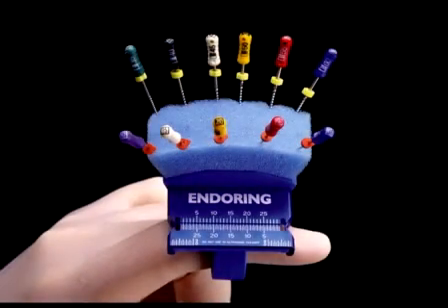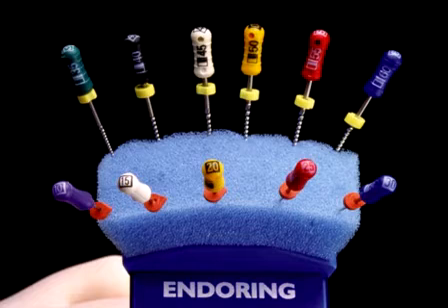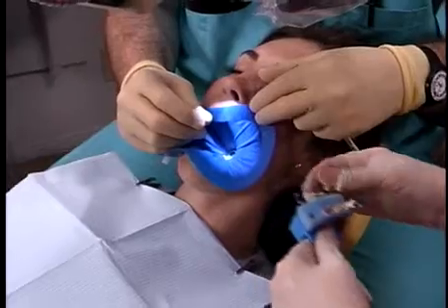The endo ring is an excellent device for the dental assistant. Not only can it hold the instruments, but it has a measuring ruler and a small well to place a rubber stop so that they can be very accurately placed on the shaft of the file. In the front row, we have a stainless steel 10 and 15 with unidirectional stops. The 20, 25, and 30 are still stainless steel, but they're flexo files which give us added flexibility. In the back row, we have nickel titanium. The dental assistant can conveniently pass the endo ring into the clinical field so that instruments can be easily exchanged.